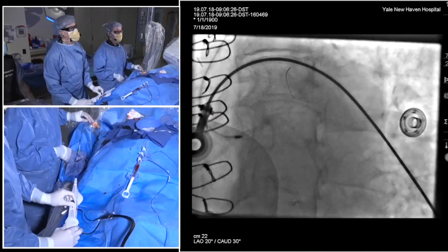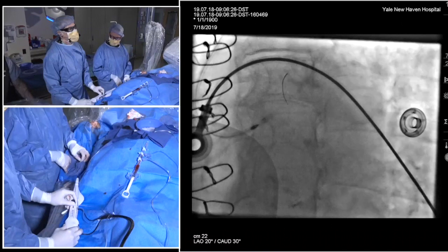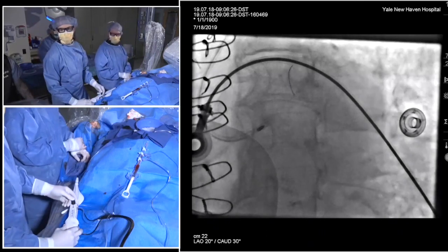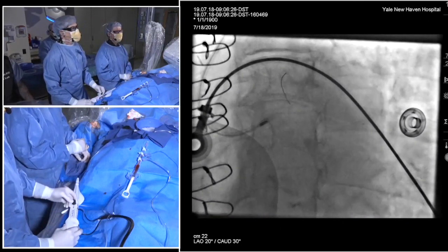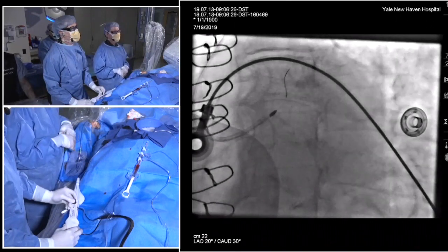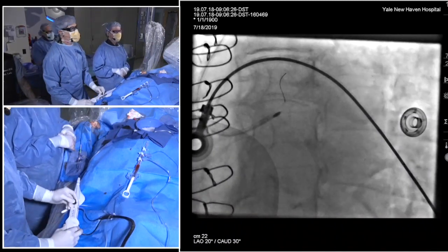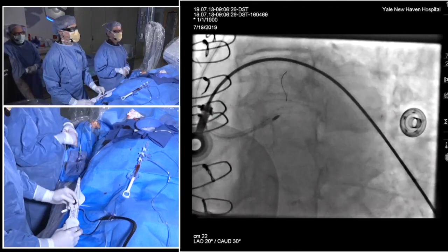And so you platformed outside the body, which is good technique; you test outside of the body. What sort of speeds are you using? What burr size are you using? We're using a 1.5 burr, and we platformed at 160, so we'll go on the slow side. It's a lot of calcium. One can make an argument with this to even use a 1.25 burr, given the severity distally. But we elected to use a 1.5.